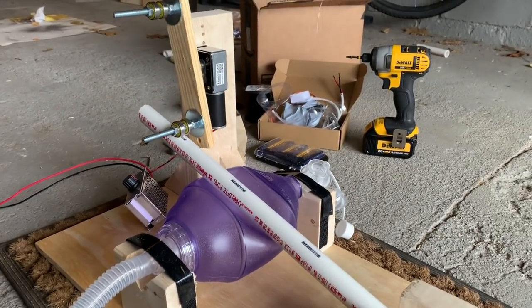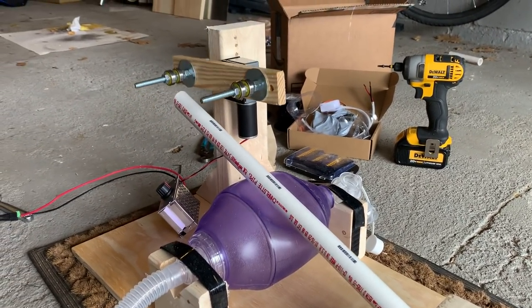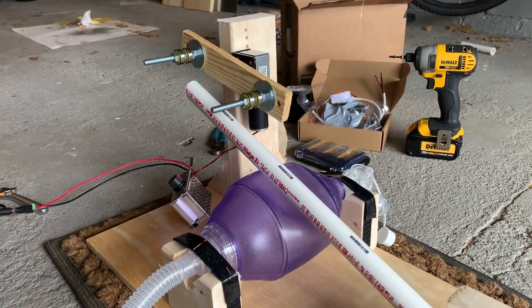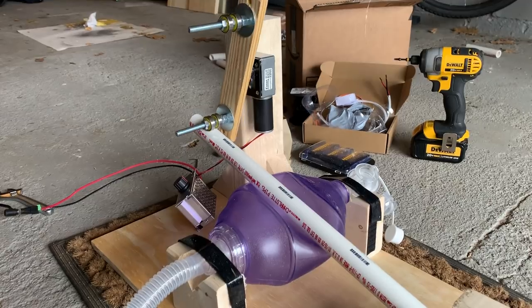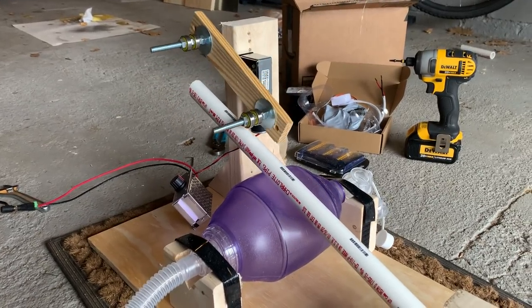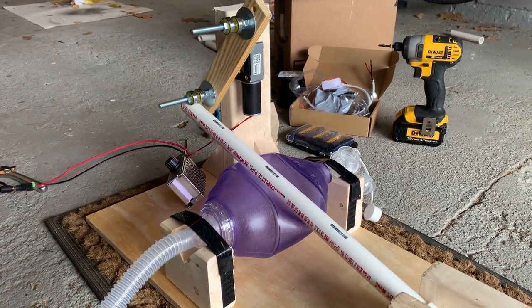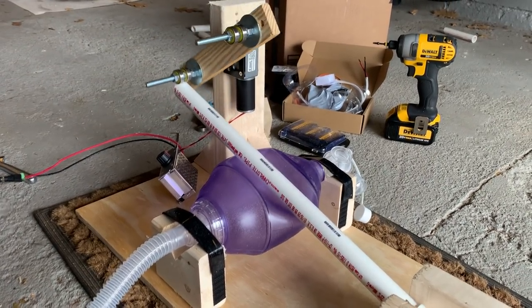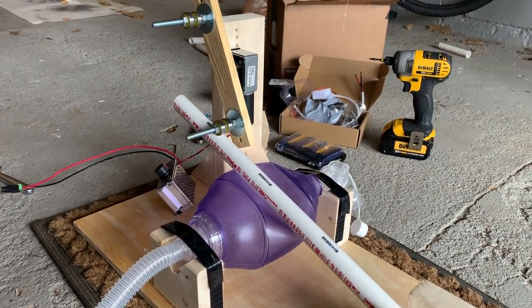Your FiO2 and humidity and such would be controlled by whatever you feed into this. Humidity, I imagine, you could add onto the end of this. I decided to build around the bag valve mask because that already sort of fits into the whole healthcare apparatus — I don't need to develop special fittings for that. This fits into the usual airway structures that are in place.